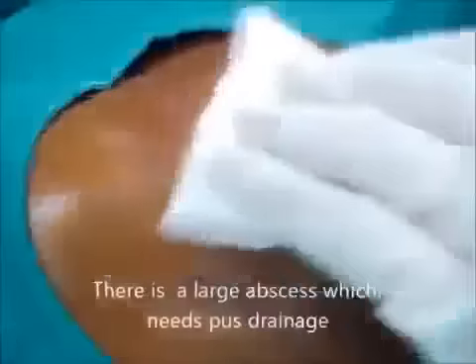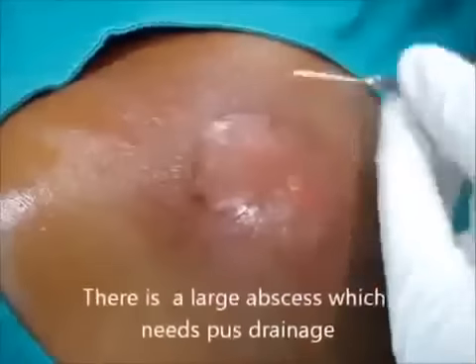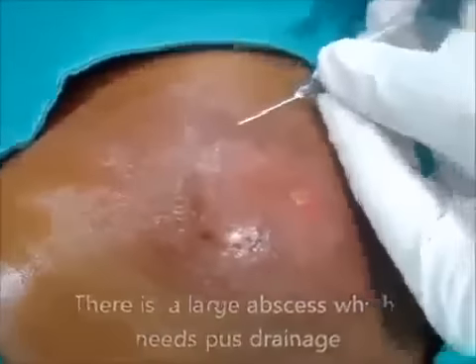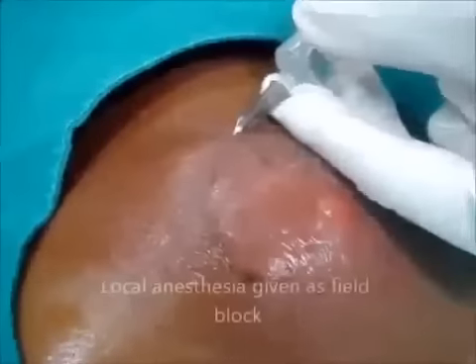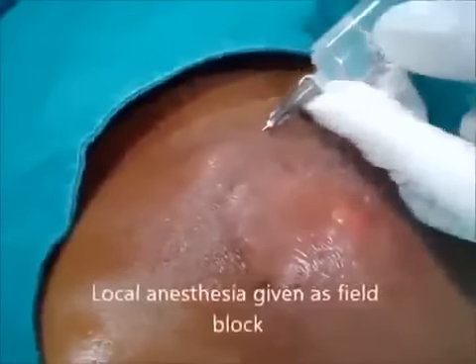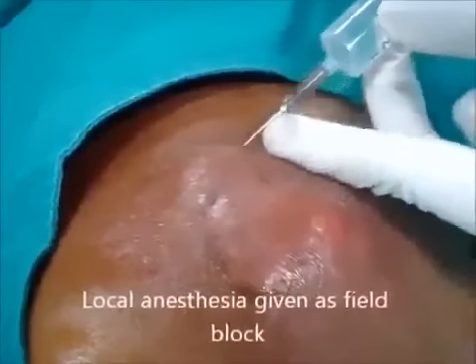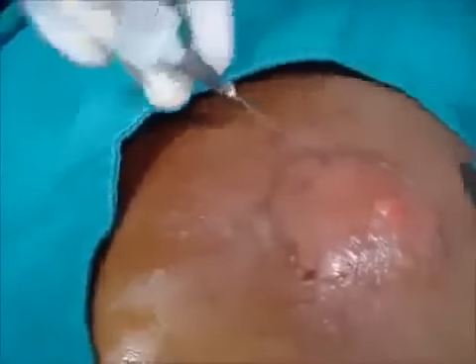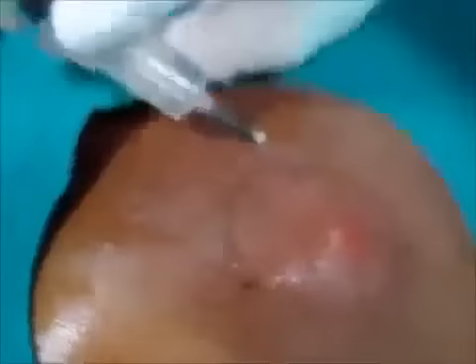Hi friends, it's a large abscess in the lower back which needs drainage of the pus. I will do this procedure under local anesthesia, and we are giving a field block of local anesthesia. Just watch the procedure — how I am giving this field block.